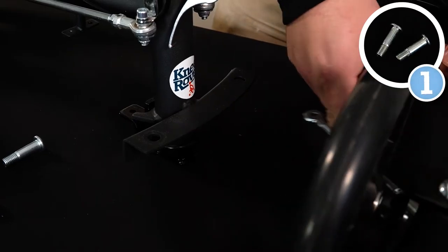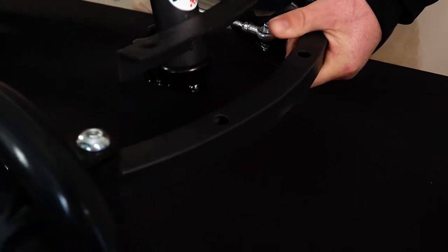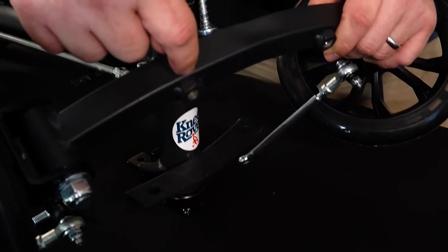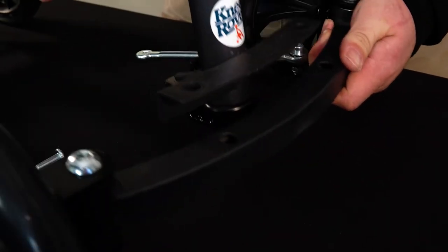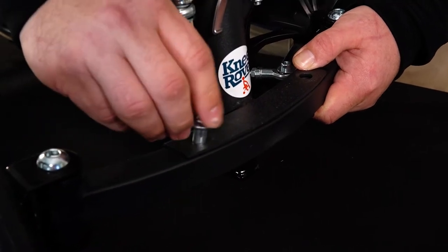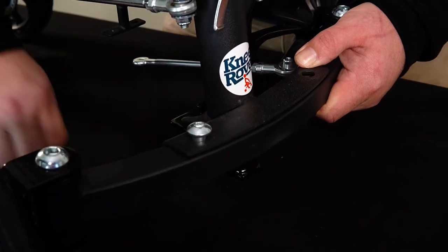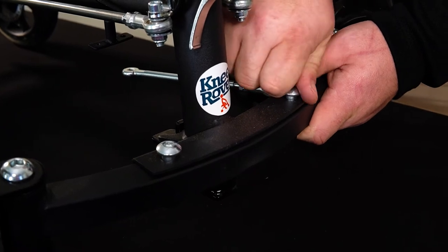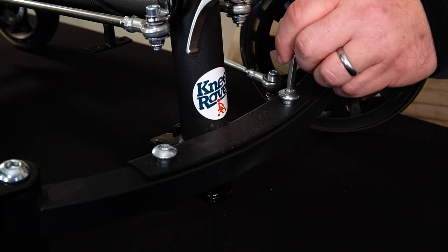Step number one, we're going to install the front axle. To do that we're just going to line these holes up right here with the front axle. Make sure that these welded-on nuts here are pointed towards the bottom. You're going to take the front axle bolts, stick them in the hole, and just screw them in. Then take the provided allen wrench and just tighten it all up.